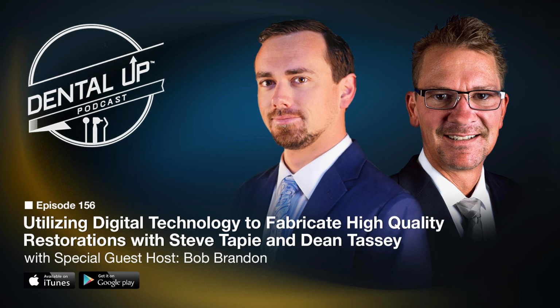What about porcelain and the ability to cut back and layer this material? What are your thoughts and opinions on that? We do it. It's possible, especially for anterior cases. The translucency of the zirconia and the porcelain together gives a very nice result. It works well with lighter stump shades. Yeah, and for characterized dentition, we are still talking about basically a monolithic material. So for characterized dentition, where there's a shade gradation between gingival to incisal or occlusal, or if there's tremendous hypocalcification or staining that we need to incorporate, I like to work with the ceramist and use a cutback technique so that we can better match the adjacent dentition on those types of cases.